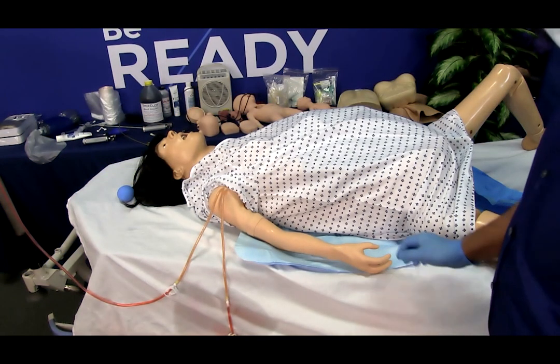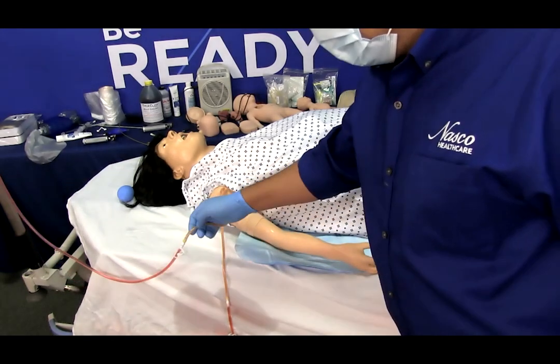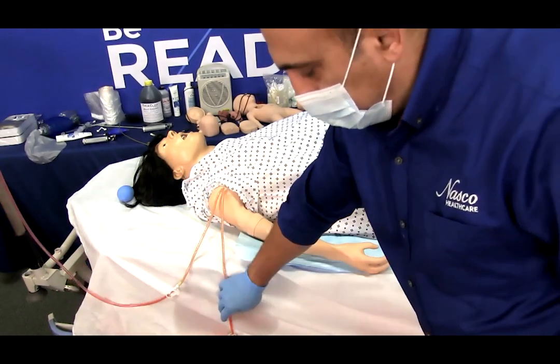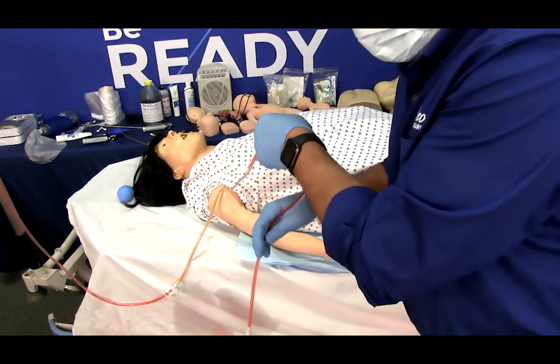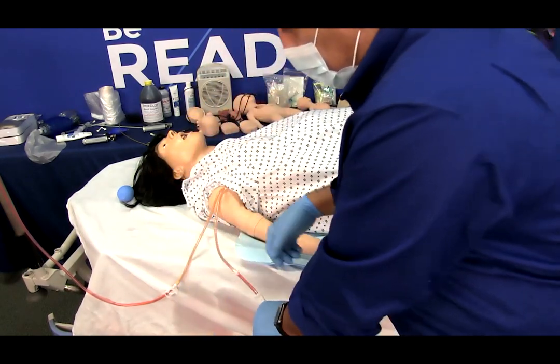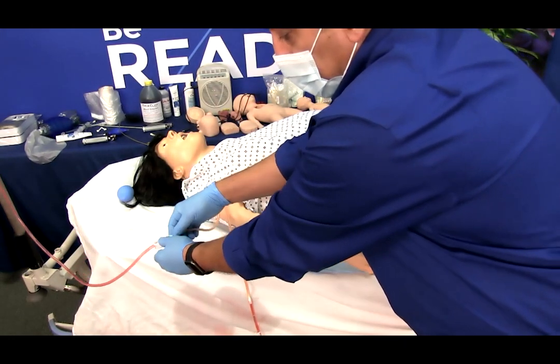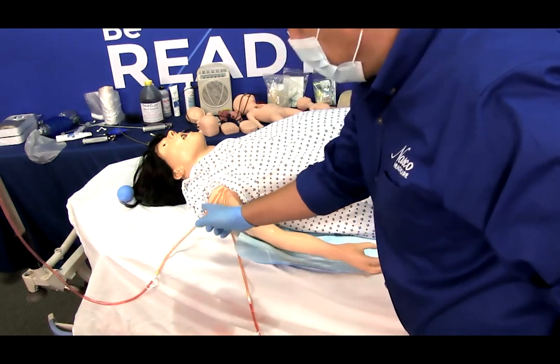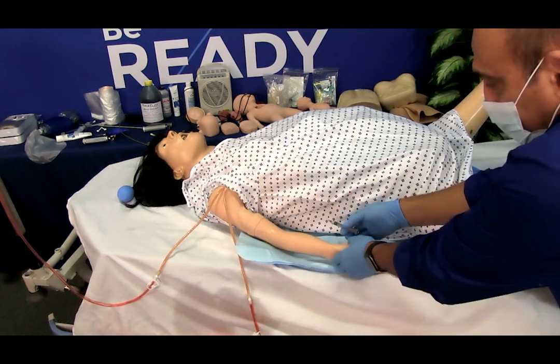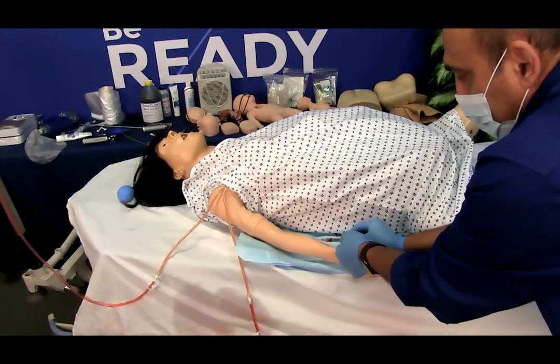To draw blood samples on Lucy, follow the procedure for setting up your IV arm to draw blood using IV bag B as the drain bag. Once the arm is pressurized and full of blood, open clamp on bag A. Cleanse the IV site with distilled water and insert IV needle or butterfly. A realistic flashback will be evidenced with proper insertion.